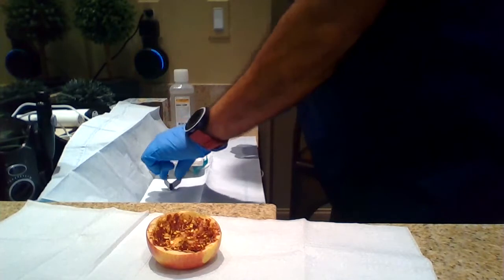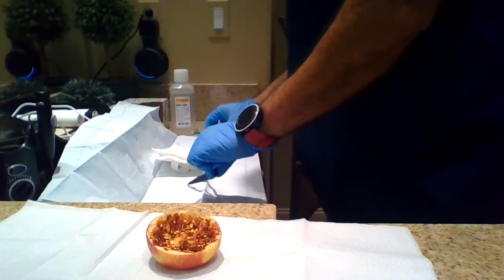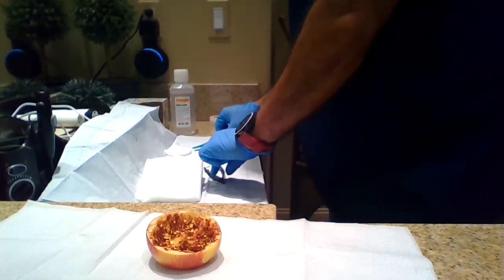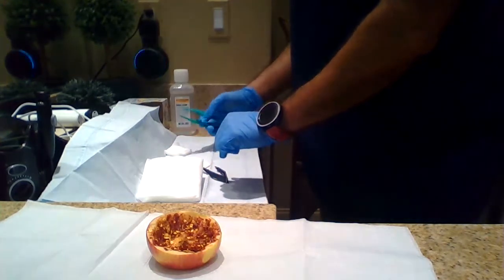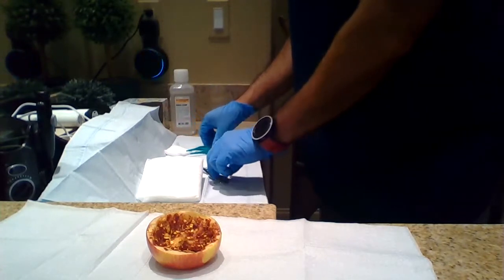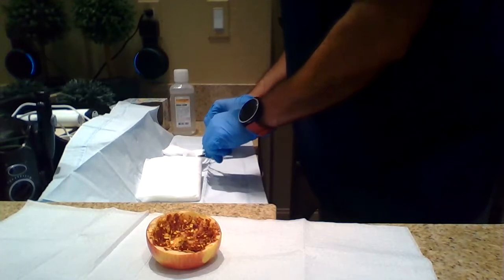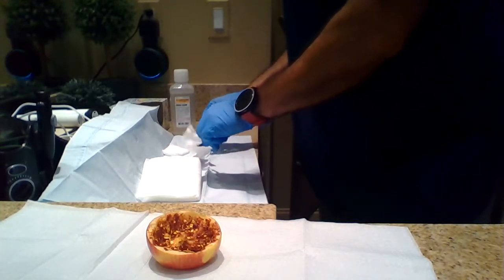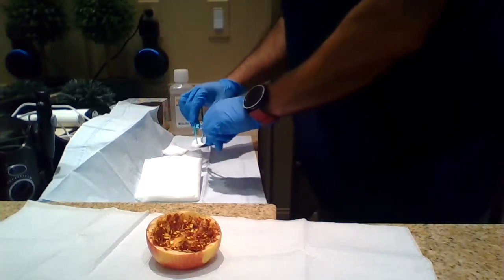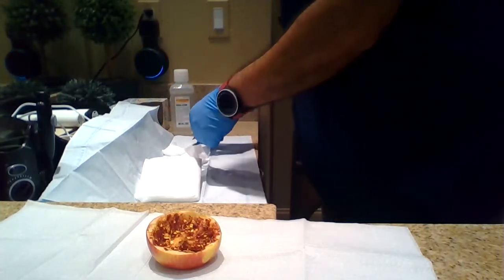So now what I need to do, I need to repack the wound. So when I repack the wound, I have to be careful not for the sterile gauze to touch the edges of the wound. So I will very carefully manipulate both of these. Again, this is all sterile. And if you need to be careful and only use one, only use one.